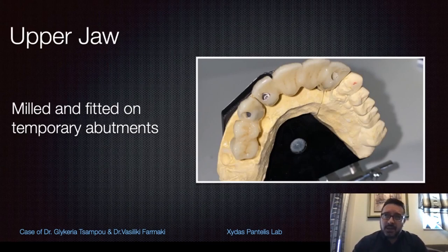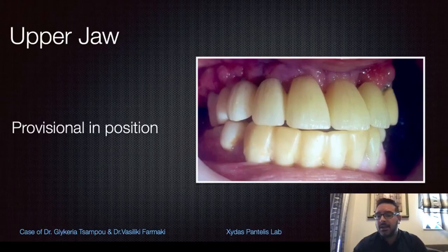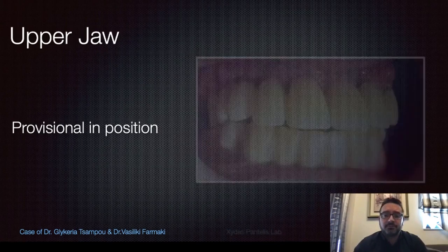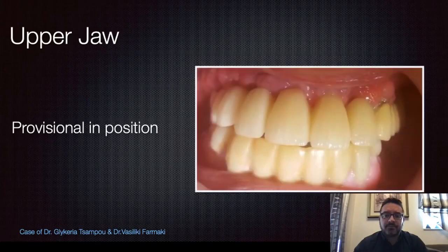The surgery took place, if I remember correctly, on Thursday afternoon, and the provisional was delivered on Friday morning. So under 24 hours, this is the clinical image of the patient the next day morning. As you can see, even though you have the extraction, because of the usage of PRF, the healing is very good. And as you can see, it's a great result for one day implant surgery.